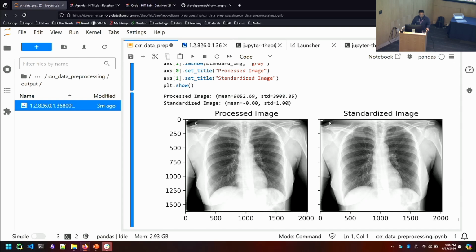So we do this mainly before putting this image into the model, the AI model pipeline, to better help the gradient learning for the model. It helps in training, and also normalizes the data so that when we receive a model from external data sites, or when we want to apply it to other data sets, the preprocessing is standard across the sites and also across data sets.